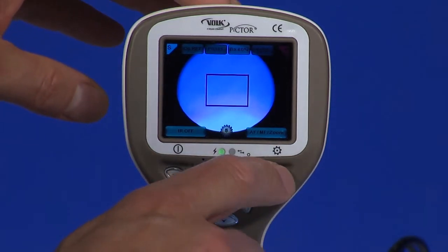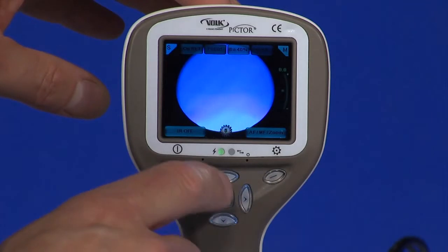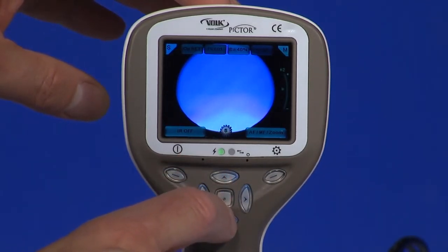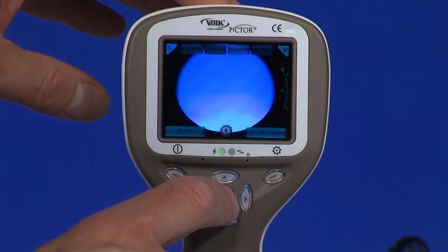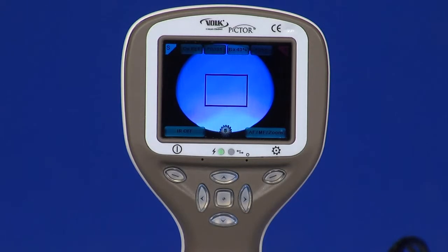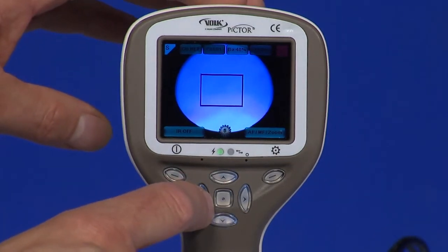Up and down arrow keys. When manual focus is active, use the up and down arrow keys to focus. Press arrow key up when the patient has myopia. Press arrow key down when the patient has hyperopia. Move the focus window left and right after pressing the middle key to activate.